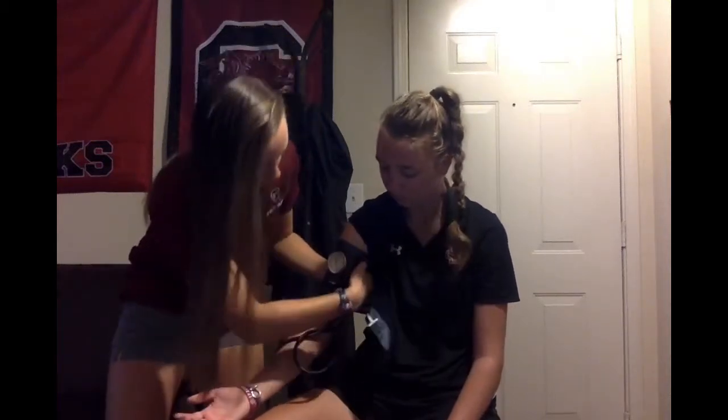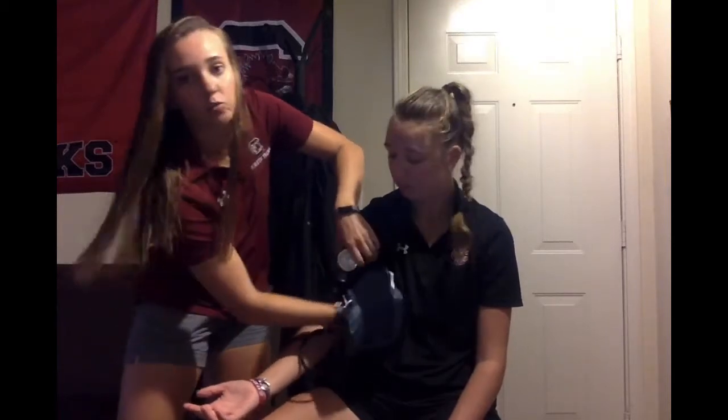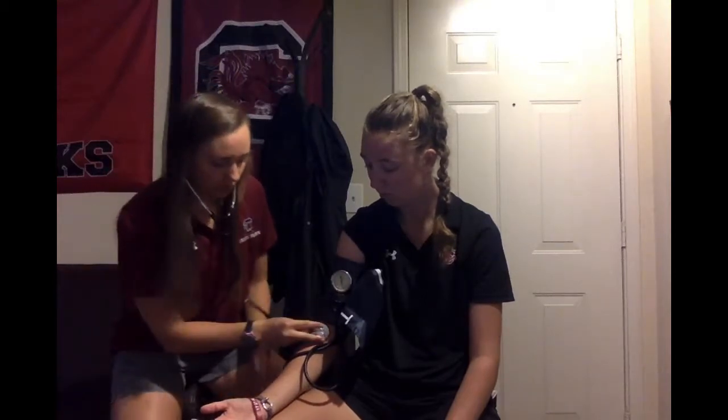You'll want to secure it tightly with the artery marker marking where the brachial artery is. Next, put the stethoscope with the ear pieces facing your nose. You're going to place the diaphragm over the brachial artery. Make sure to use your fingers and not your thumb.